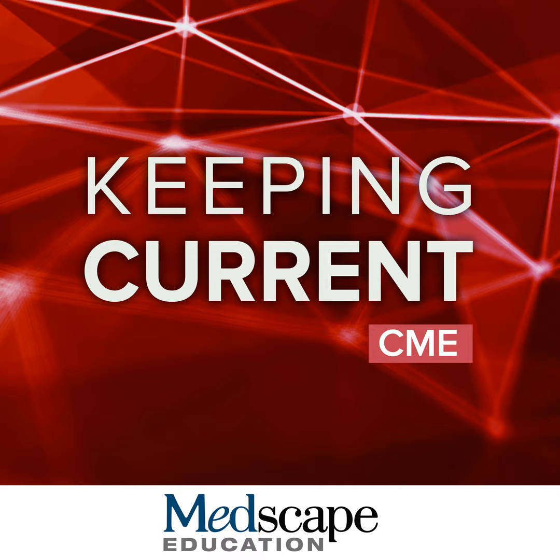So in conclusion, hepatobiliary phase abbreviated MRI has been studied and is clinically used at UCSD for those patients who have repeated poor visualization scores on ultrasound. Hepatobiliary phase abbreviated MRI is one of the recommended studies by LI-RADS ultrasound surveillance for patients with poor visualization of the liver on the ultrasound. And I want to stress this: more studies are really needed to fully evaluate all these abbreviated MRI protocols.